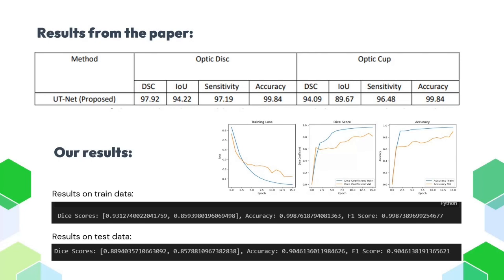These results highlight both the effectiveness and areas for improvement in our approach, demonstrating the model's potential while also acknowledging the challenges in matching the paper's performance.